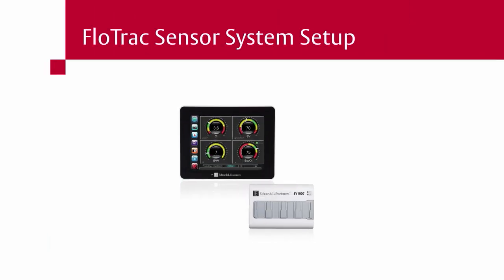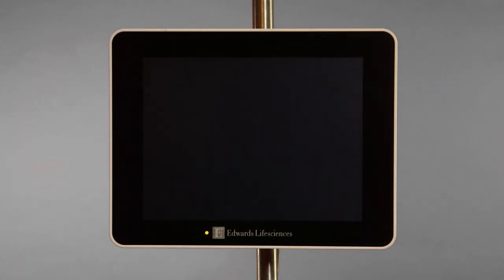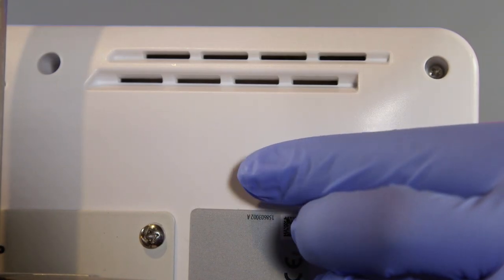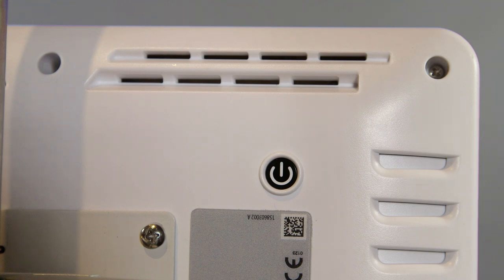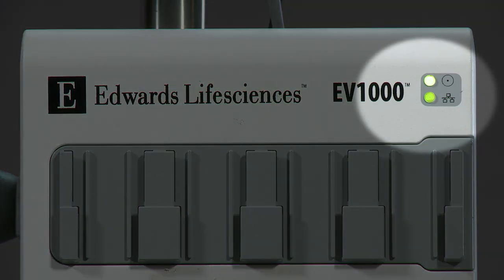Make sure the power cable is connected to both the monitor and data box, and that an Ethernet cable is present between the monitor and the data box. Turn on the EV-1000 Clinical Platform by pressing the power button on the rear of the monitor. Confirm that the data box LED lights are both on and green.